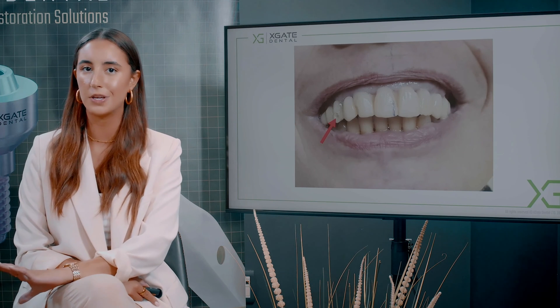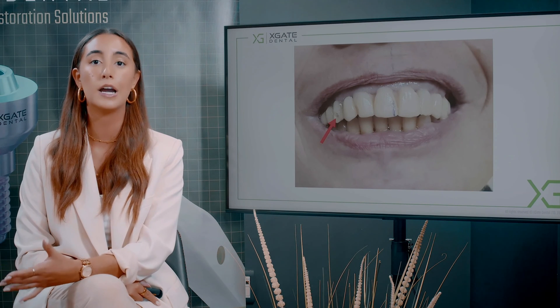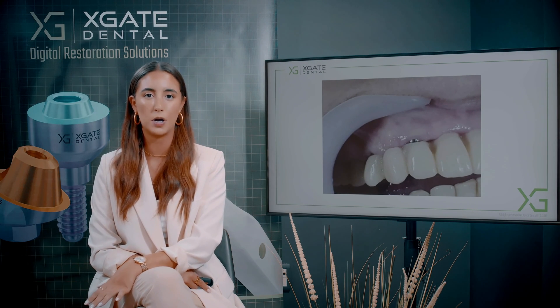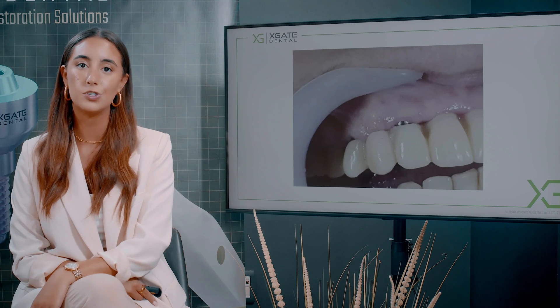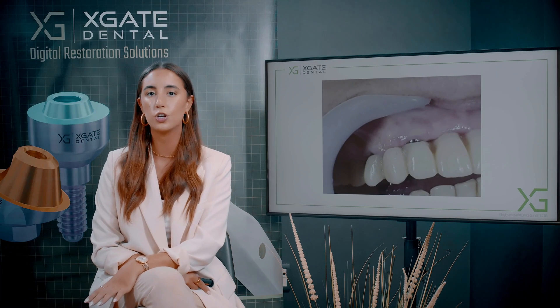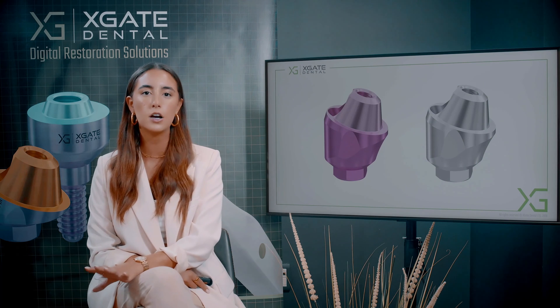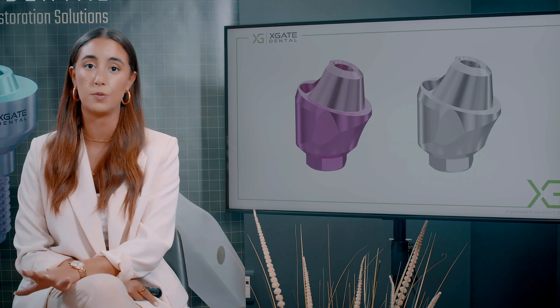Here you can see the multi-unit and the implant after osseointegration. The gingiva had a little recession — you didn't see it earlier due to inflammation making the gingiva appear very large. Now you can see healthy gingiva in a good color. The inclination of the implant was buccally inclined in the anterior area, so an angulated multi-unit was used. After healing, you can see some recession and the metal of the angulated multi-unit. The bridge looks very nice but the metal part of the multi-unit is visible. We chose to anodize the multi-unit in a pink tissue color, so even with recession and visible metal, it masks the metallic reflection through the gingiva.